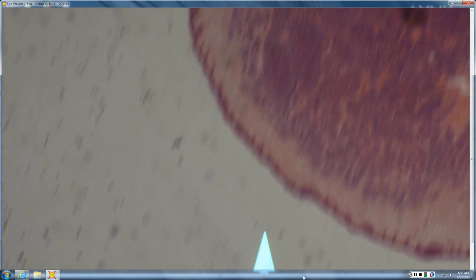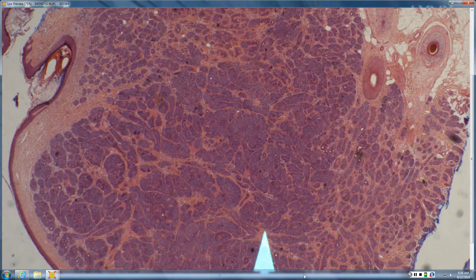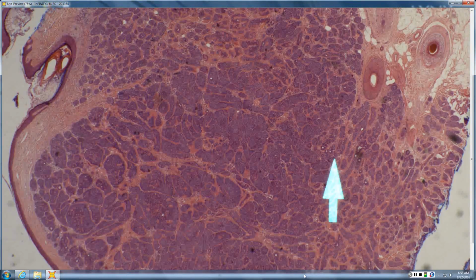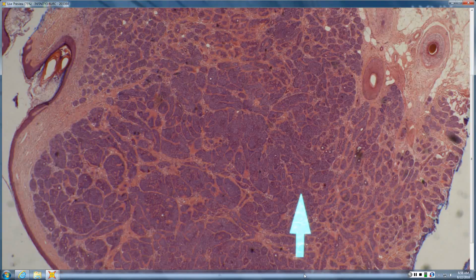Okay, so now the fun things. This one is a cylindroma, although as I think in here, one of the answers is a hybrid, meaning that you can have spiroadenomas that have components that look very much like cylindroma and vice versa. But this is classic cylindroma, so you get this jigsaw puzzle formation of this dermal proliferation. These differentiate toward the secretory component of the eccrine gland.